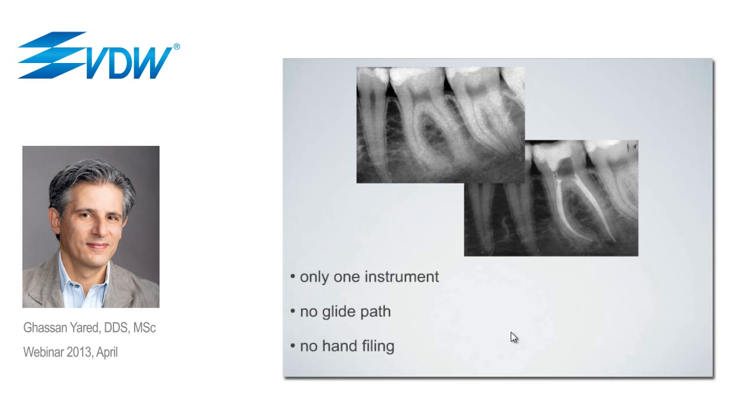Now, for this case, the working length was estimated from the radiograph. A stopper was placed at that estimated length minus 4 or 5 millimeters. The R25 here was used as described with a packing motion, 1, 2, 3, very small movements, taken out, patency, irrigation. We continue doing that until the instrument reaches the estimated working length minus 4 or 5 millimeters. Then a hand file, number 8 or 10, straight, is placed in the canal to determine the working length with an apex locator, preferably.